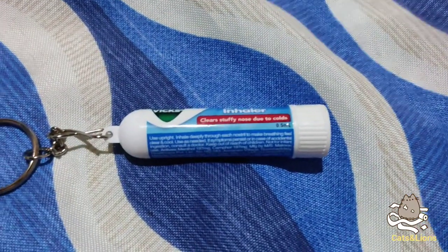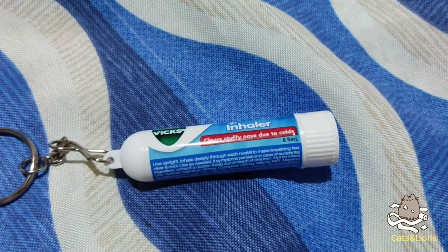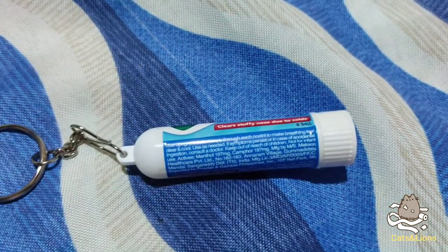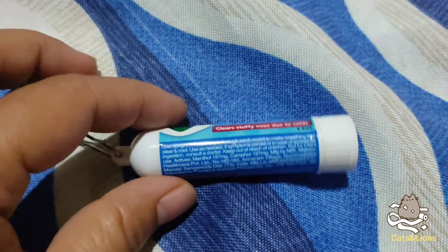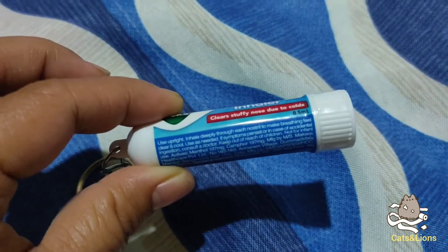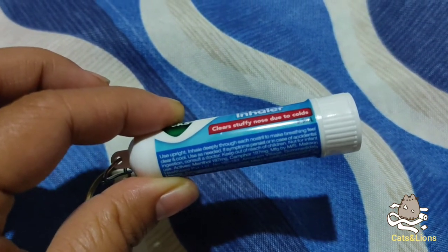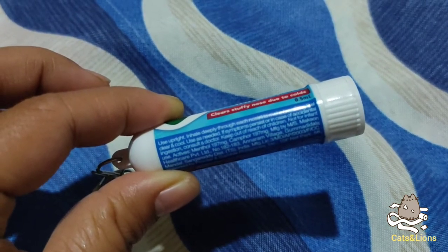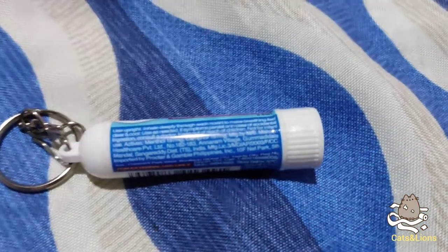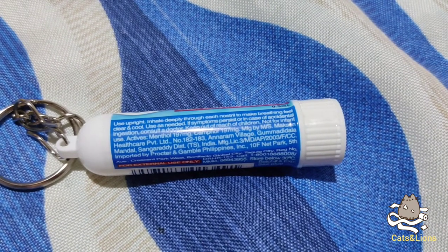Inside we have 0.5 ml solution — 0.5 ml medication. It says here that you have to use it upright and inhale deeply through each nostril to make breathing feel clear and cool.